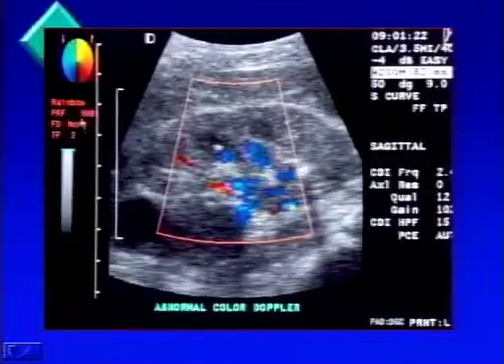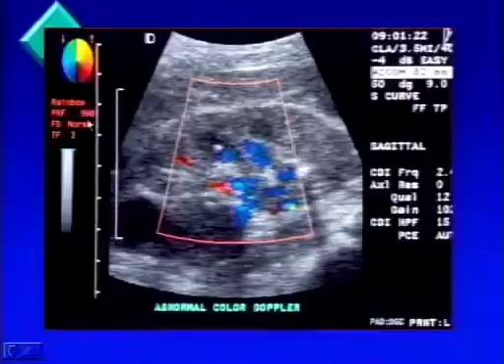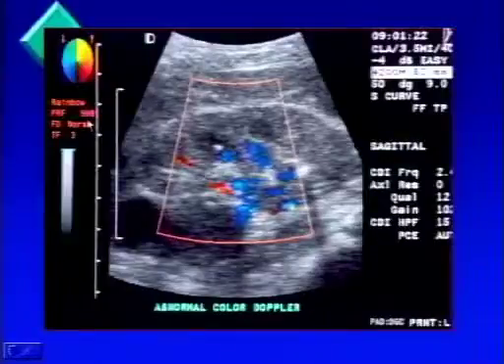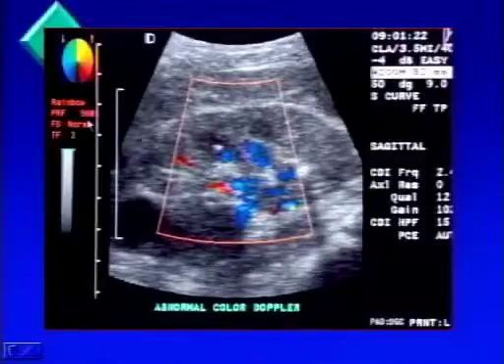We check over here to the upper left. We see that the pulse repetition frequency is set at 900 hertz. Typically, we would have it adjusted around 1,000 to 1,500 hertz for the indirect method. If we were doing the direct method, where we evaluate the higher velocity pulsatile flow in the main renal artery, that PRF would probably be set around 2,000.